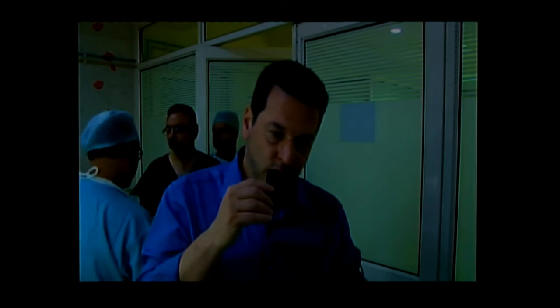Because I found that if you treat the whole length and 360 degrees, you get much better results than doing just one part of the vagina. The only exception is localized vulvodynia or pain in the scars after delivery. Then I treat only the point of pain. But otherwise, I treat the whole length from 360 degrees.